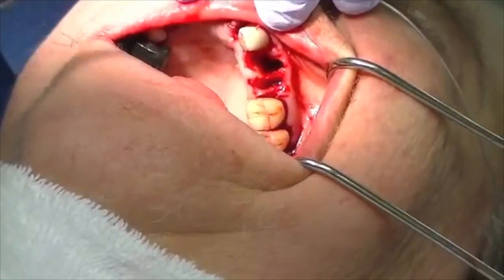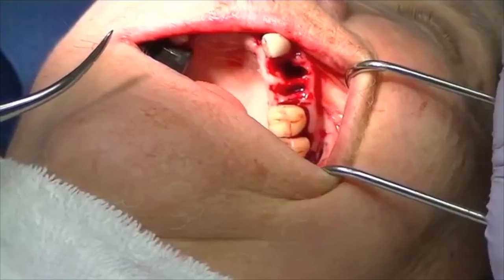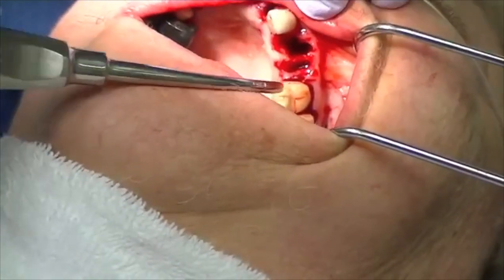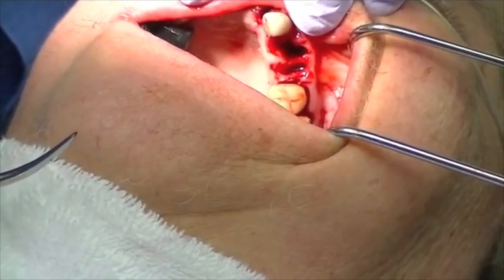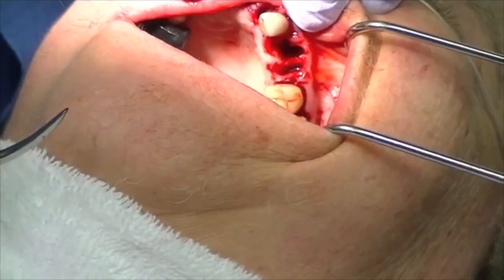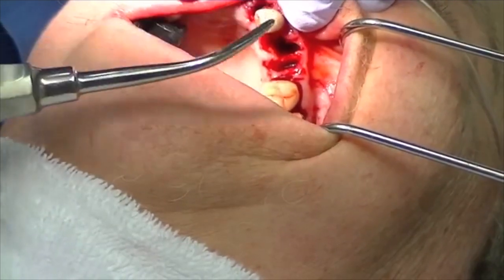On the upper left side, we've removed everything except the cuspid and the two molar teeth. Removing a second molar can be a little difficult, as many of us have experienced, in that we have a tuberosity that oftentimes attaches to the tooth, which can make extraction difficult.